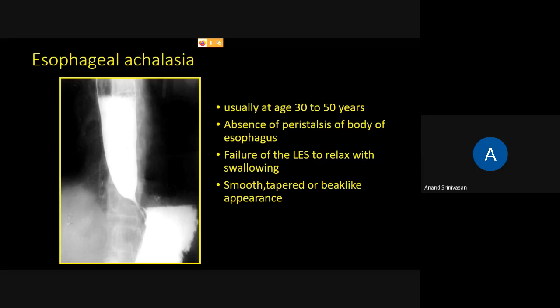Absence of peristalsis and, sorry, there is a smooth tapered beak-like appearance.